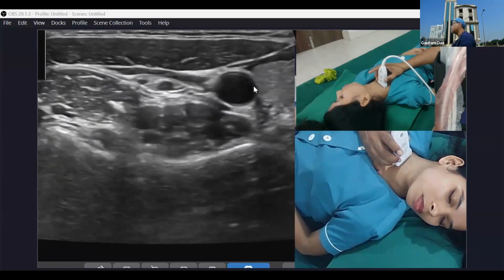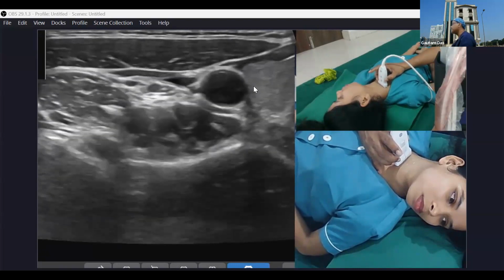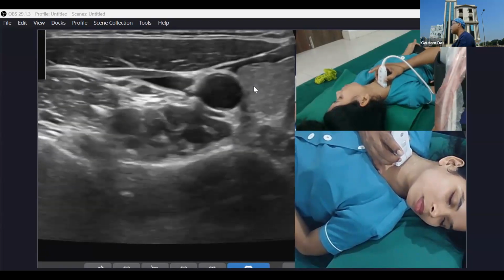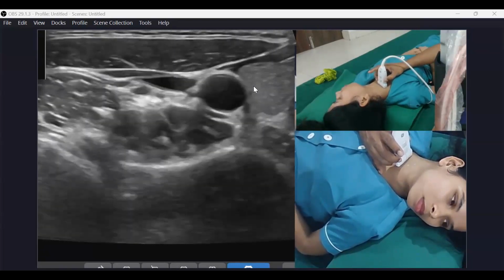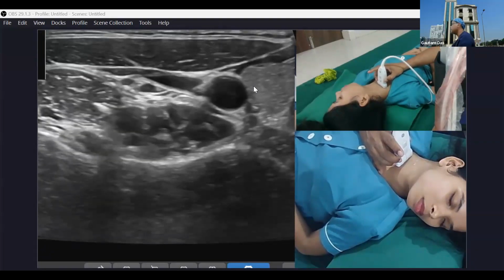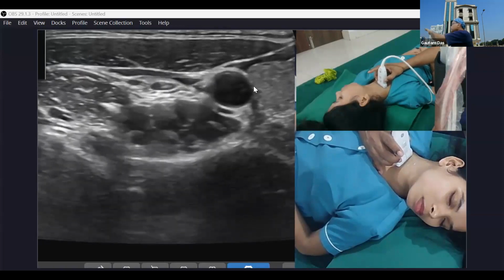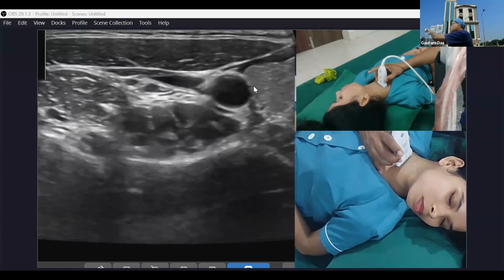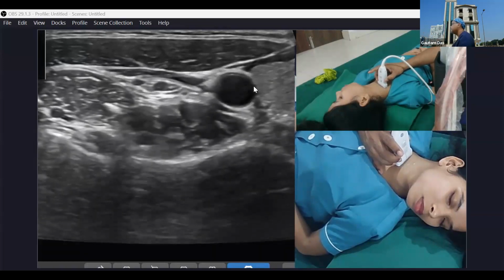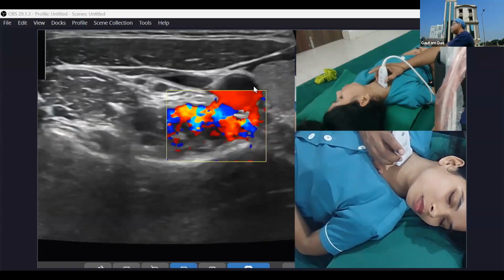And look at another thing. Look at the carotid. Can you see something is passing? Some black structures, just below the carotid artery? I'm just toggling it a little bit above and down, and some stuff. So that is your inferior thyroid artery. So this is also a danger when you are doing it. Can everybody appreciate the inferior thyroid artery? Okay, let me put the color there. So just below the carotid artery, that is your inferior thyroid artery.